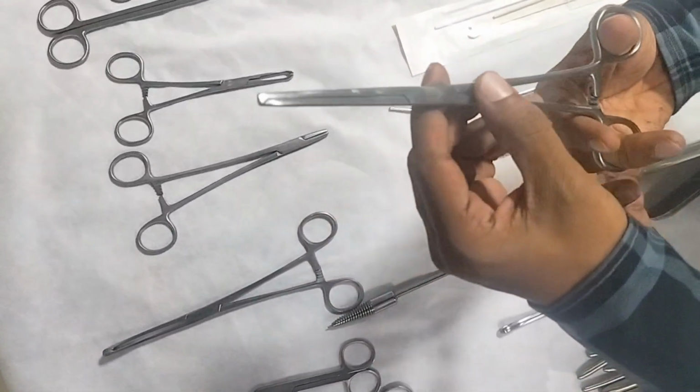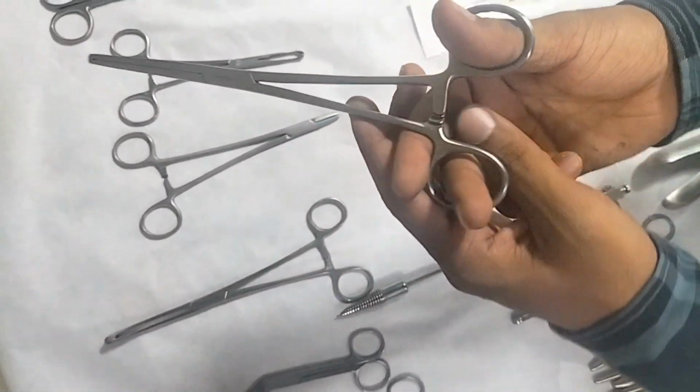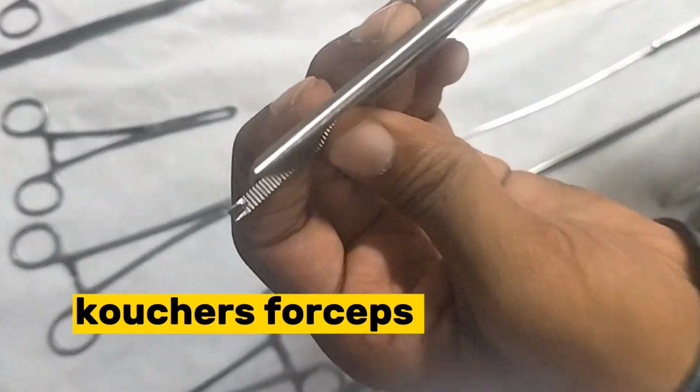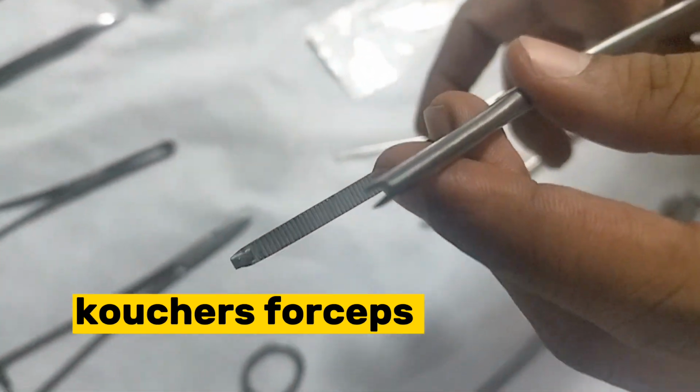Here we got Kocher's forceps. In the proximal end you can see a ratchet lock with 3 or 4 levels, long shaft, and in the distal end you can see conical projections on both ends. Okay, one end has a groove and the other end has teeth, sawtooth-like. It is used for artificial rupture of membranes, and it will also hold tough structures, for better grip.